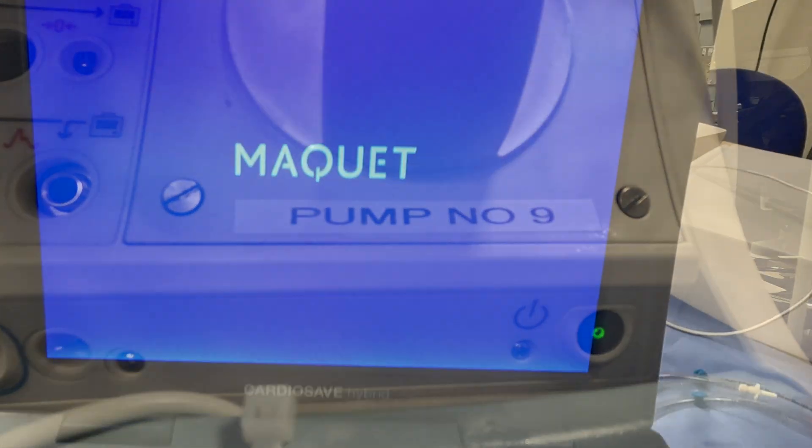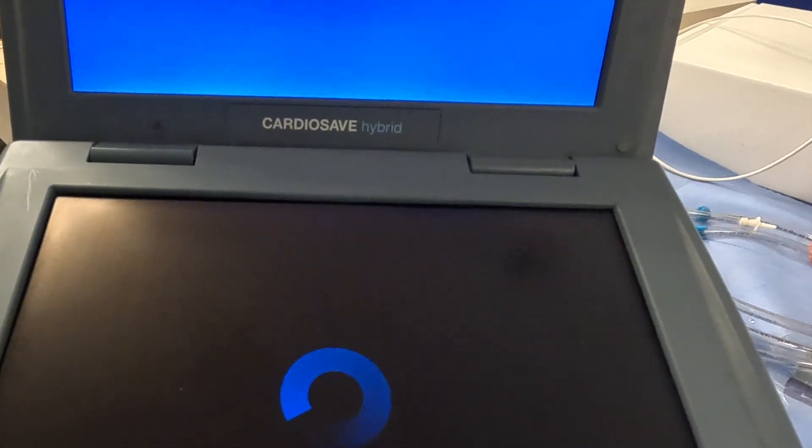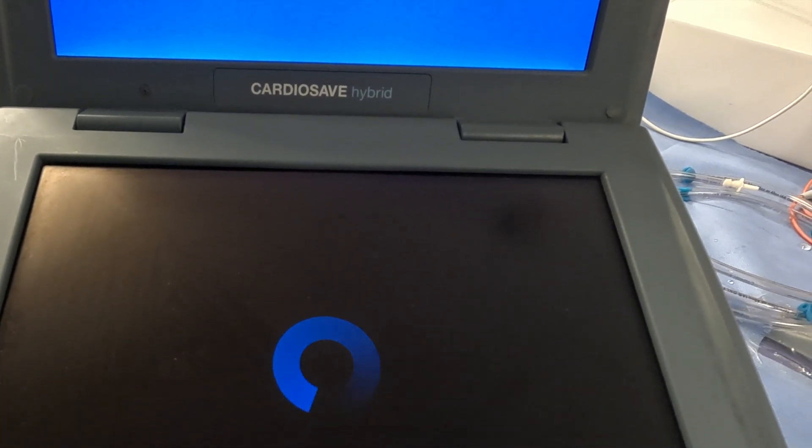Hi all. In this video, let's see how to insert a Fiber-Optic Balloon Catheter.